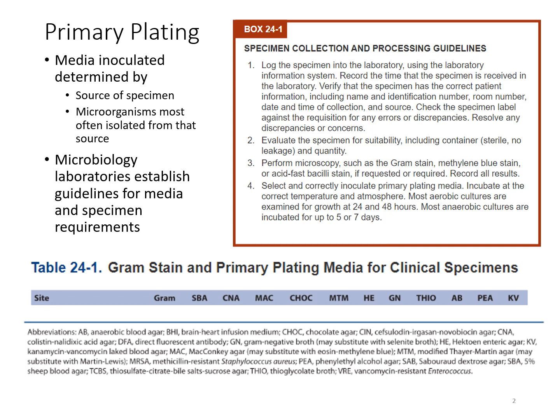And then lastly, you will select and inoculate the appropriate media for that particular sample. And then you will incubate it at the proper temperature and atmosphere for whatever particular organism you're trying to cultivate. And so most of your cultures will be examined at about 18 to 24 hours, depending on your site and what their criteria is. Depending on the sample, some samples might incubate for 2 days before you actually read them, but your site will have those procedures in place for those particular samples and cultures that you're going to be performing.